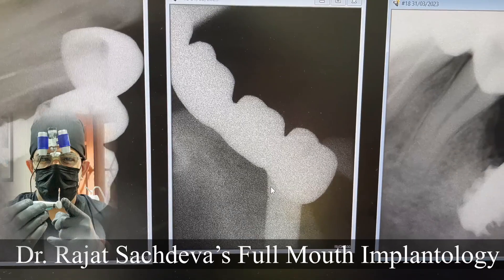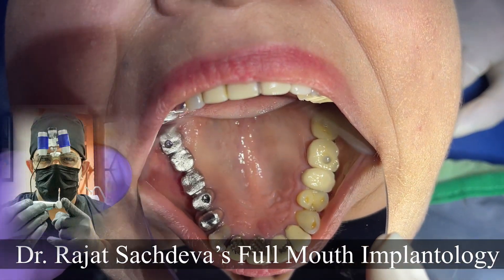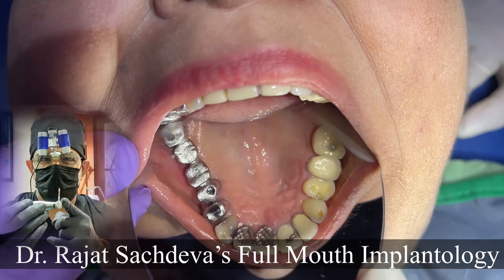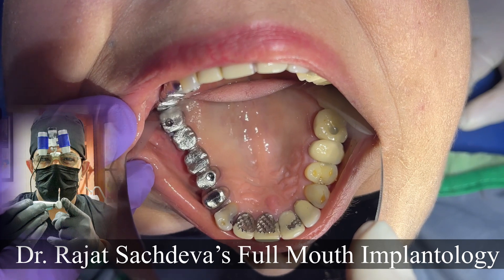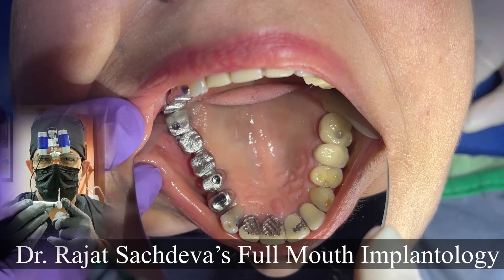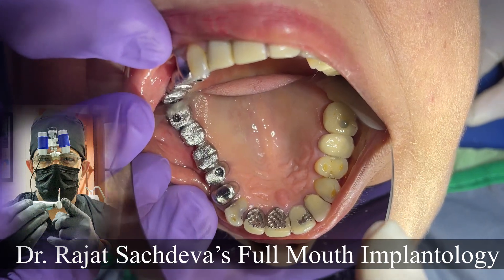This is a clinical interpretation. Now you can see there is a framework trial. You have to see how the occlusion load is, and with it, the screw access hole — you can see it because it is a palatal placement. This framework trial is a very important step before you give the final restoration.